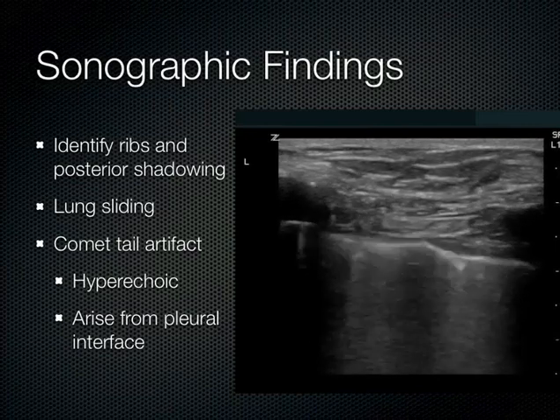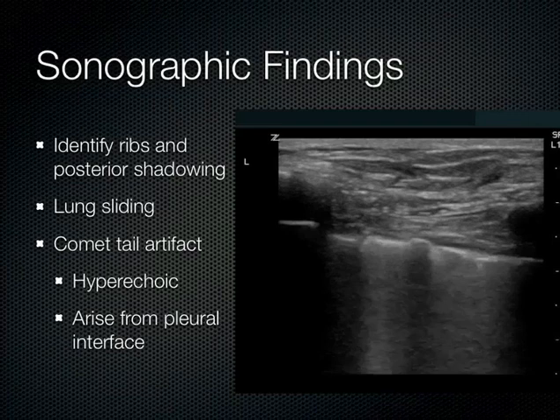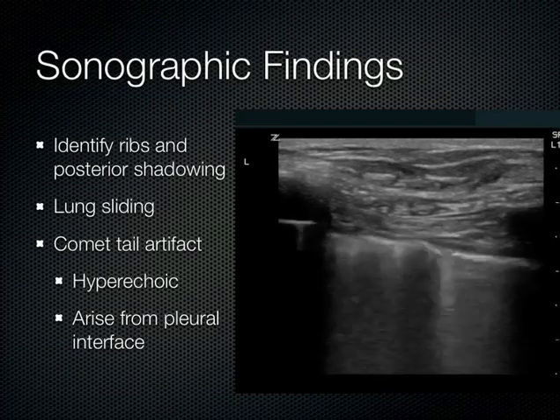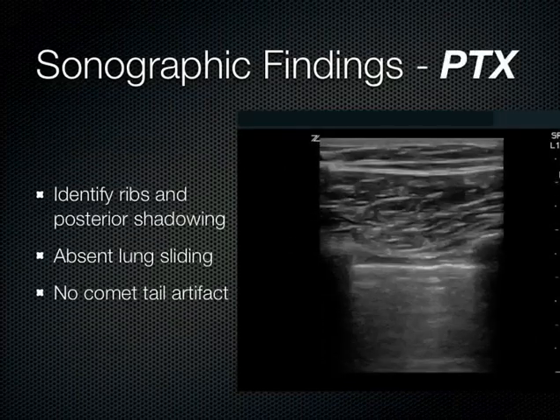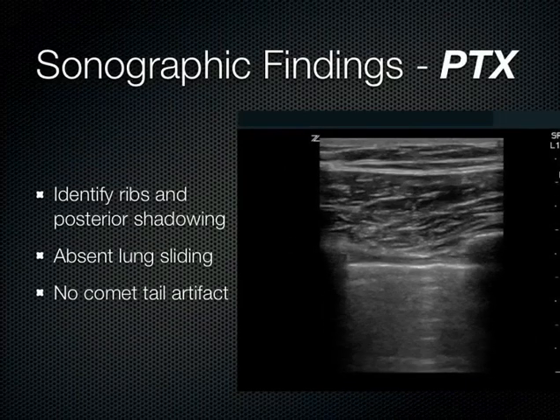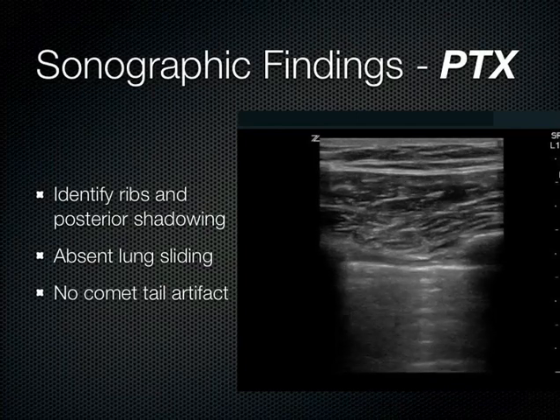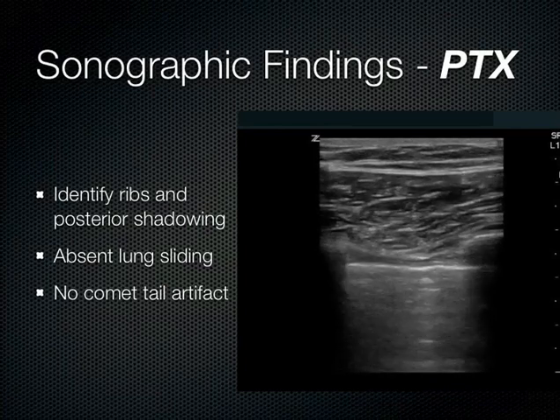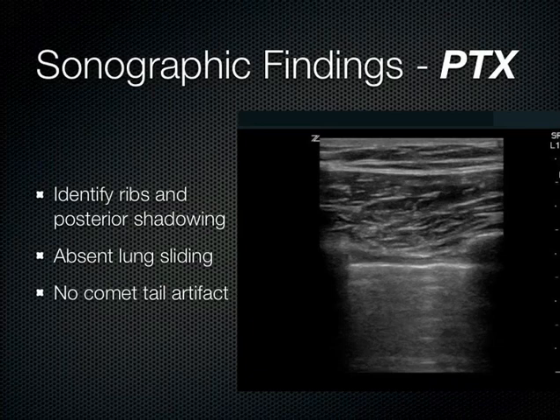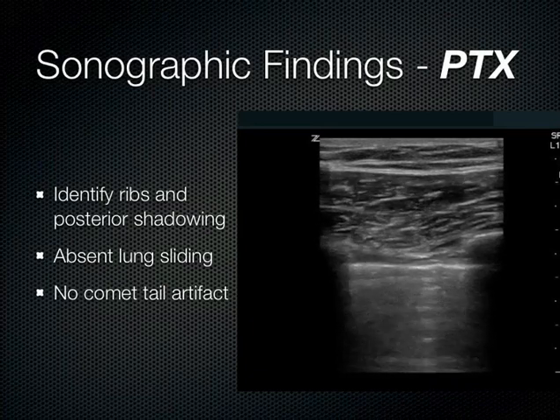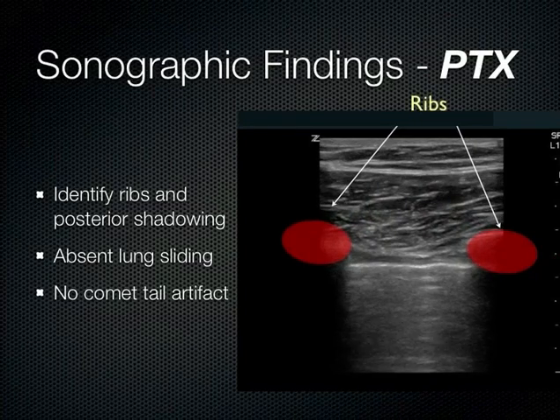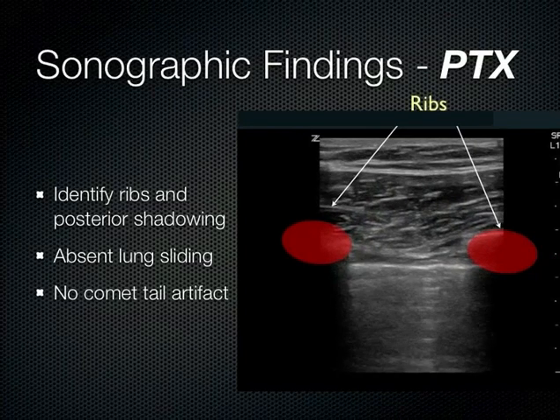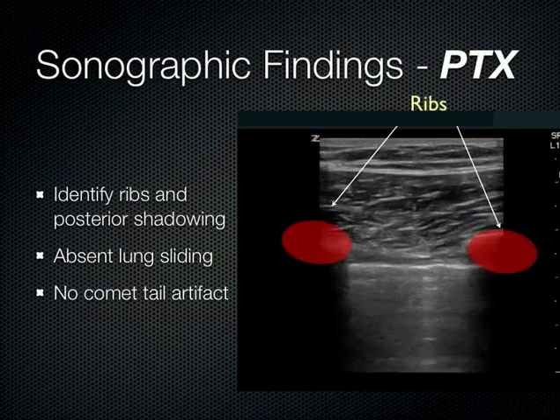In pneumothorax, the patient is still breathing, so you see some movement of the chest wall from the intercostal muscles contracting. But as for sliding — you don't see anything. Sliding has been described as marching ants or shimmering. If you don't see that effect, you have to be concerned that the lung is not touching the chest wall. You can also appreciate there's no comet tail there, and there may even be a hint of an A-line at the bottom of the screen.